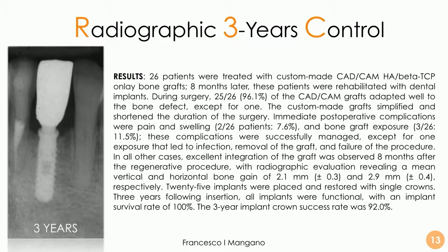If we use artificial intelligence now with specific software like ReLU or DiagnoCat, then we can have an automatic reconstruction and segmentation of the bone into a 3D model. And everything is definitely easier than in the past and faster.